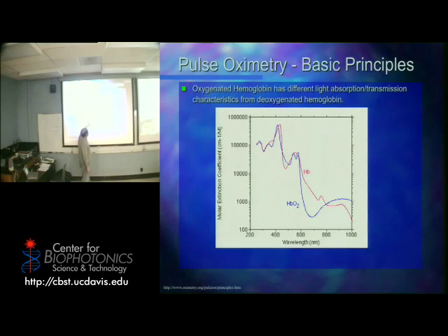Now, what you notice is over here there's a lot of overlap. But there's a nice clear difference here, right? And there's some difference here. What region is this? Okay, what part of infrared? Near, far, mid? Near infrared. Your TV remote control is smack dab right here. This is the wavelength that your TV remote control uses, around 925, 950. So there's some variation here and there's some variation here.